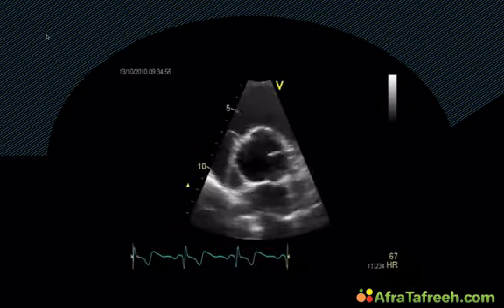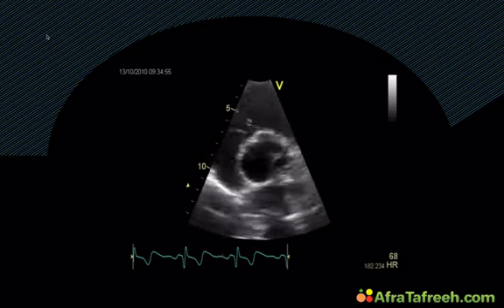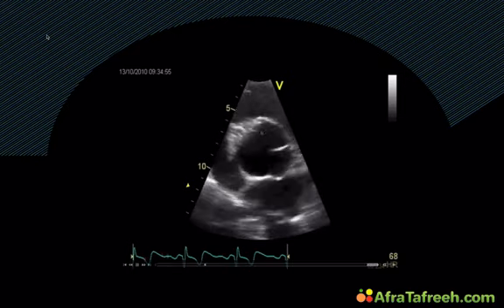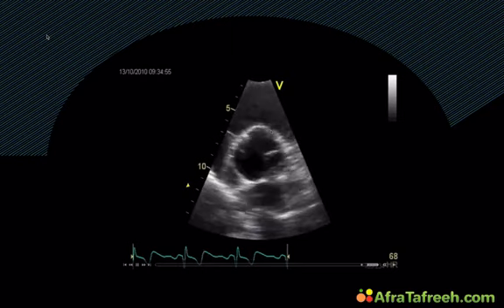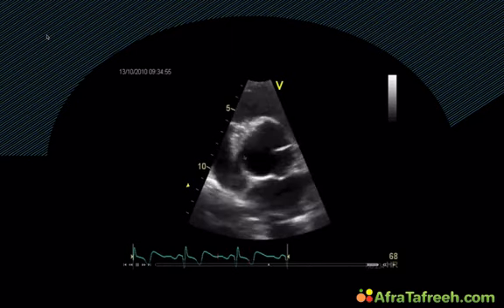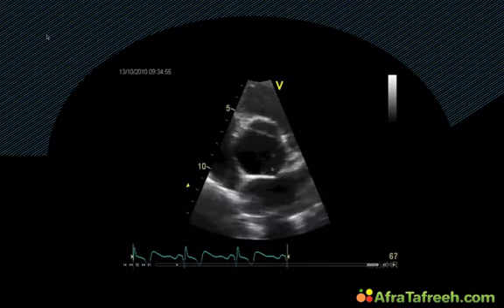Now, what next? The next step I did was obviously to look at the aortic valve. And as you will probably all agree, clearly the aortic valve has 3 cusps, right? We have the right coronary cusp here. This here would be the acoronary cusp, and this would be the left coronary cusp.